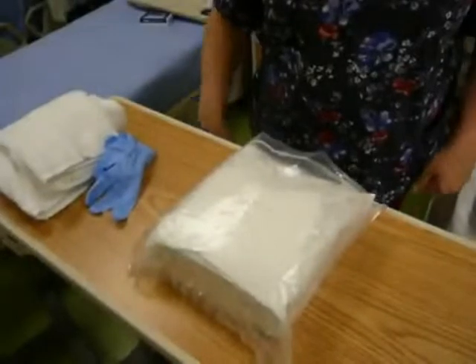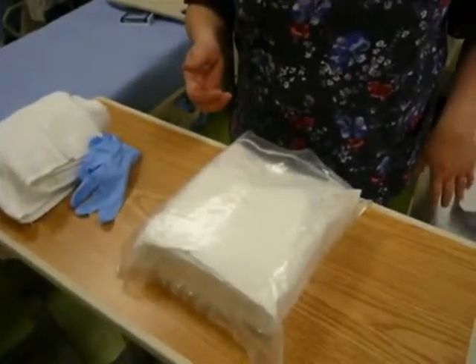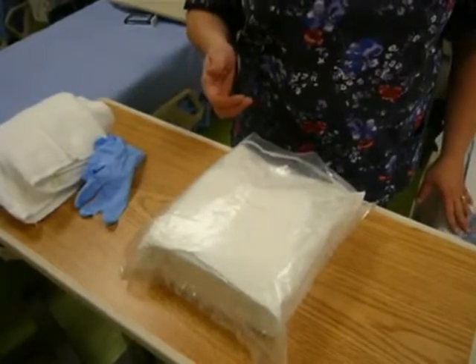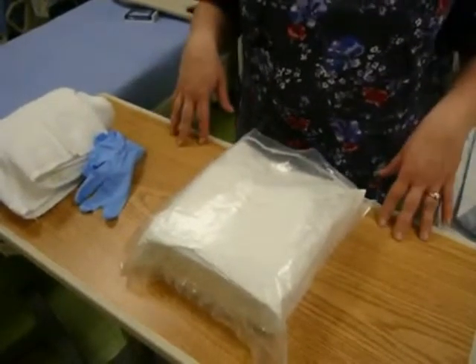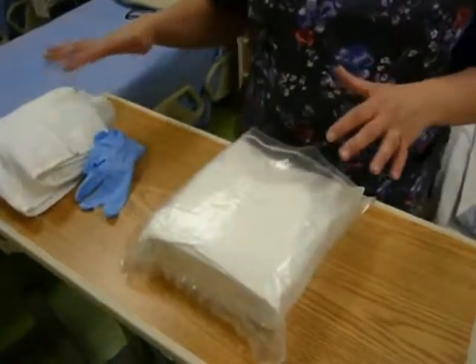Female foley catheter insertion. Before I start, I need to make sure that I have the right patient, that I've checked orders, that the height of the bed is at waist height or higher, I have a clean bedside table, my patient is in the right position, and that I have all of my supplies.